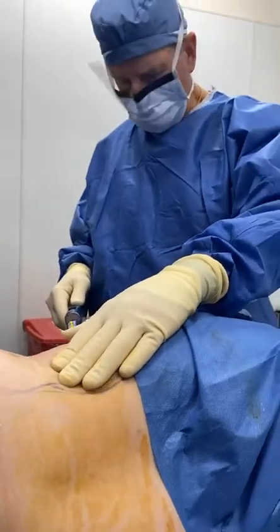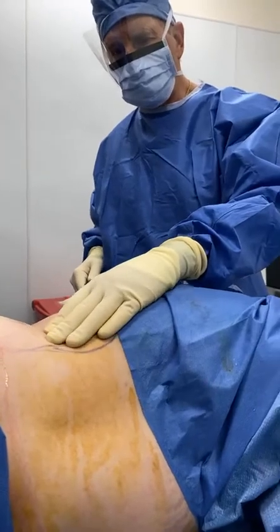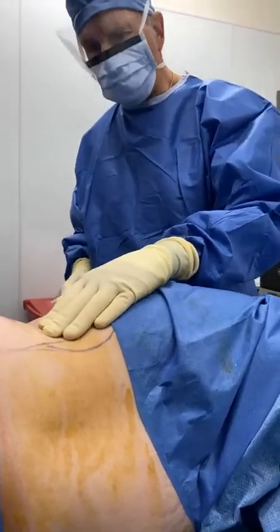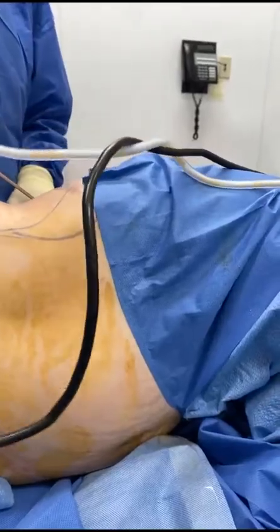This patient is actually under tumescent anesthesia and oral sedation. How are you doing? How are you feeling? I'm doing good. She's doing good. What color is that, Emily? Yellow. Yellow, beautiful puffs.